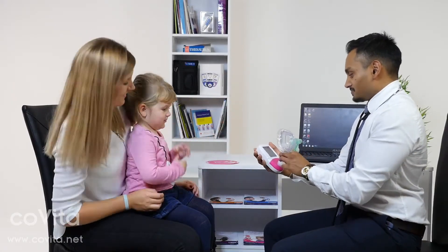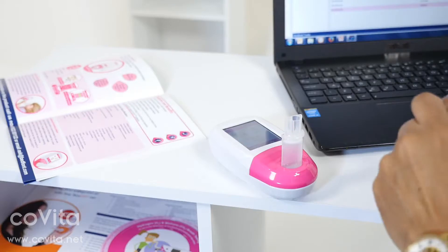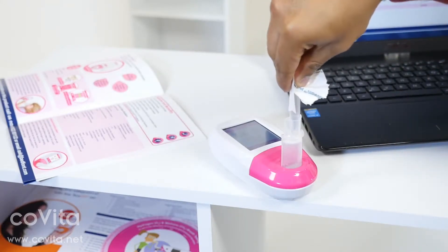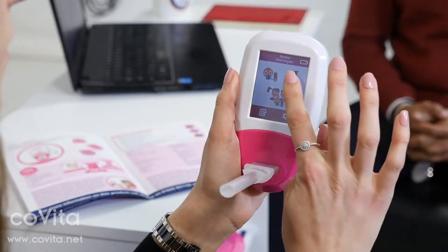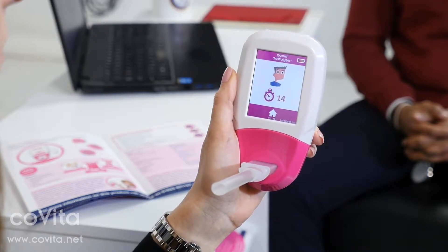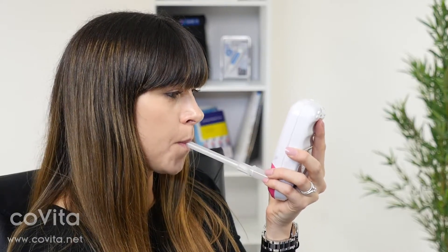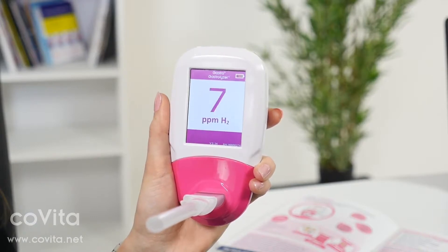When the test is finished, you can either choose to take another test, save the reading to a patient's profile, or return to the home screen. To take a breath test with the mouthpiece, attach the Steribreath to the D piece and then the D piece to the Gastro Plus Gastrolyzer. Press the breath test icon to begin. You will be asked to inhale and hold your breath for 15 seconds before slowly exhaling into the Gastro Plus. The reading will rise and stabilize on screen.